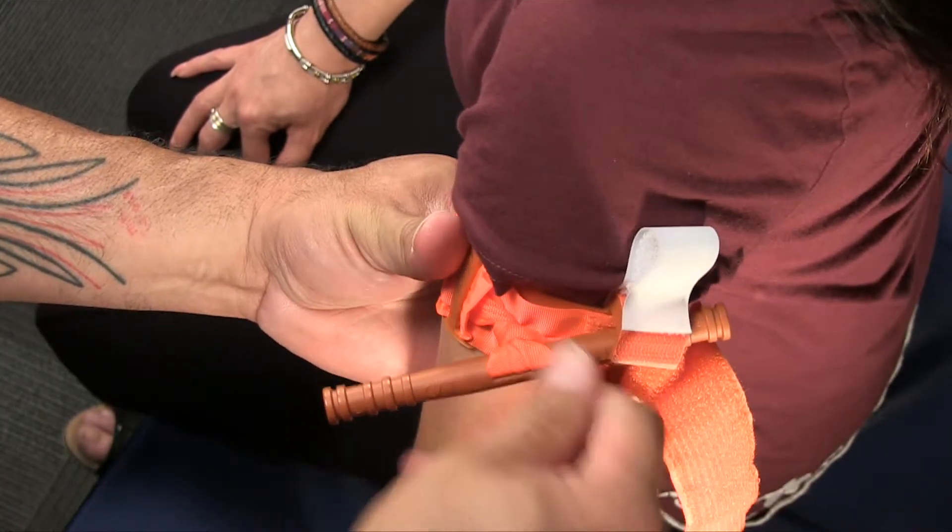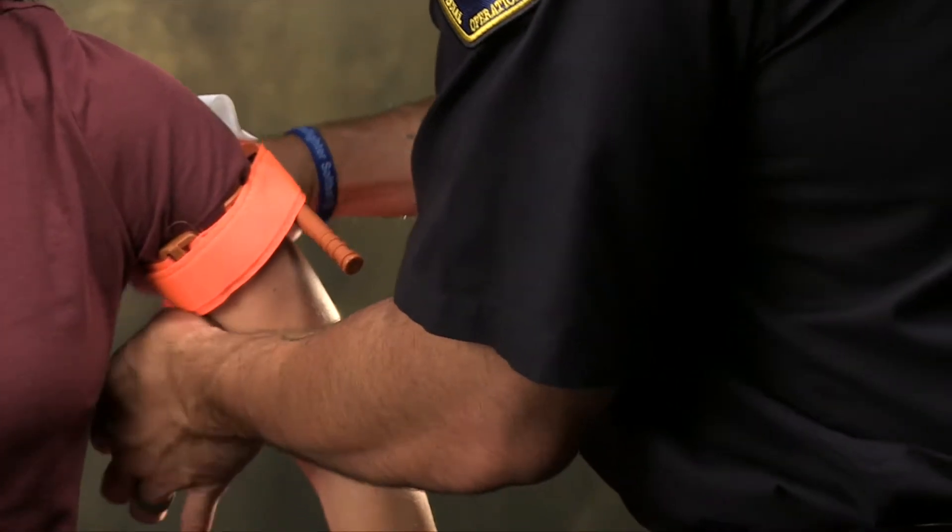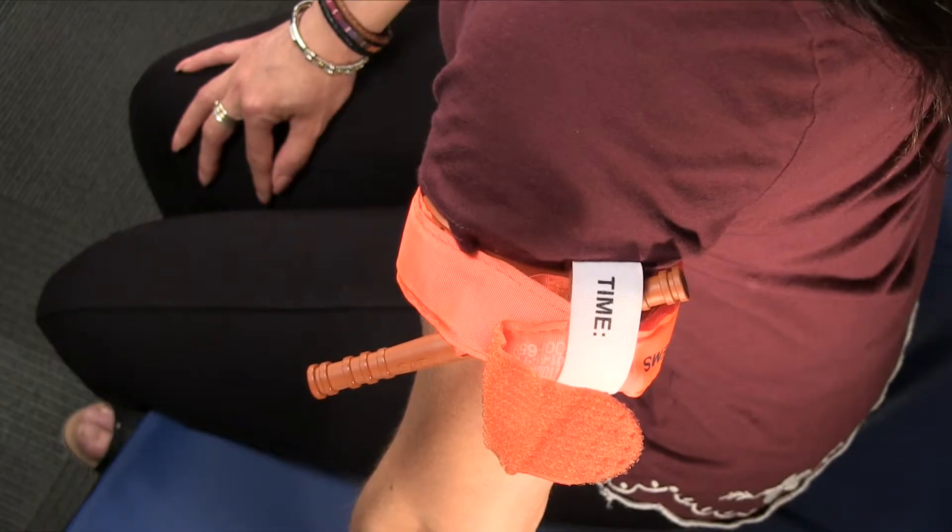Then secure the windlass in the clip. Pull the remaining band through the clip and place the securing strap over the clip. Write the time on the tourniquet if possible.